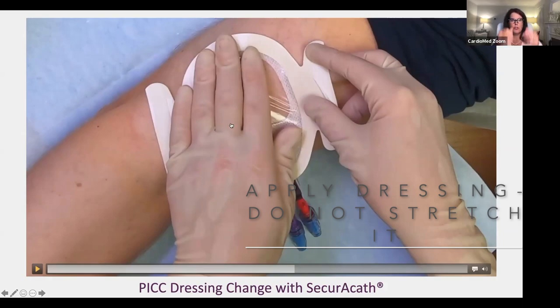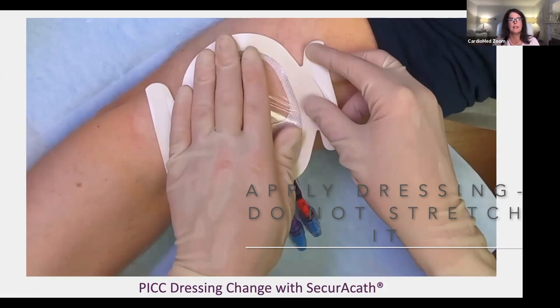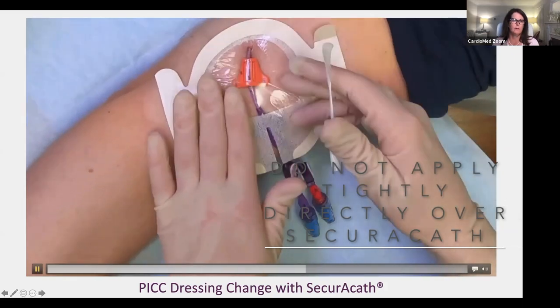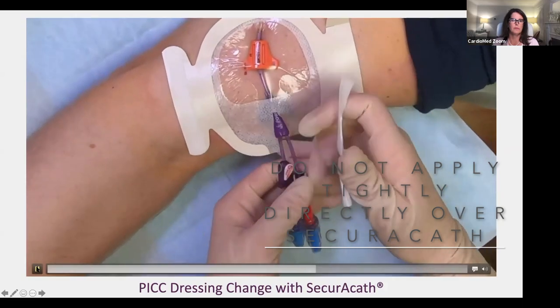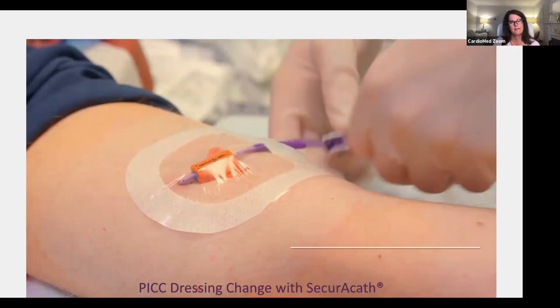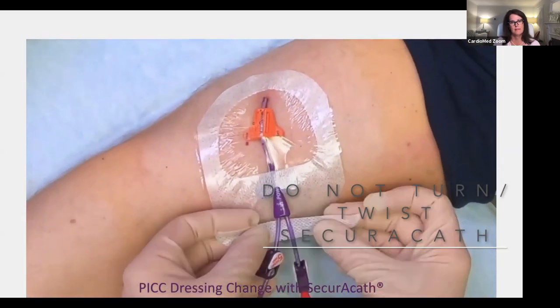So what you can do is just let it drop loosely over the site, not stretching it when applying it, so that it tends not to be stretched. The SecurAcath works with all dressings and or antimicrobial discs. Do not apply the transparent dressing too tightly. Do not turn or twist the SecurAcath from its original position.